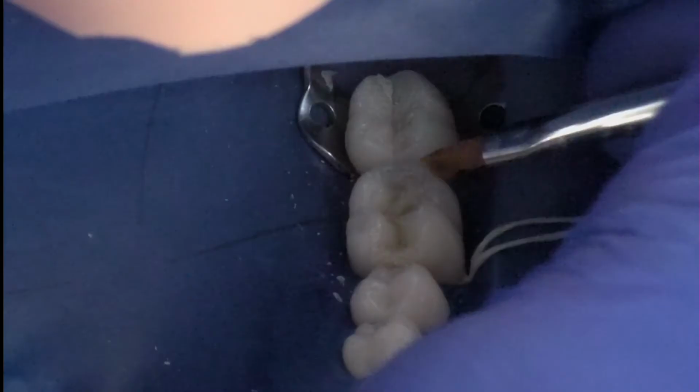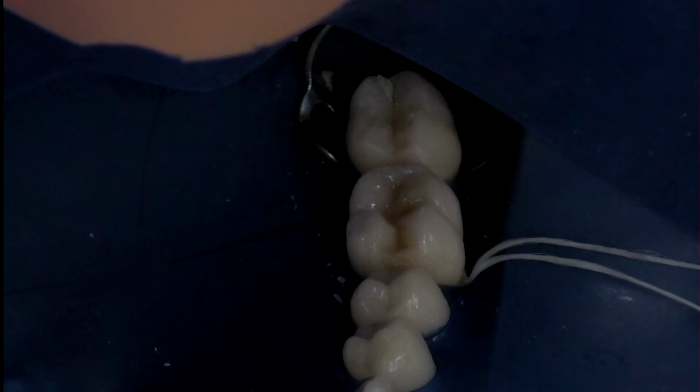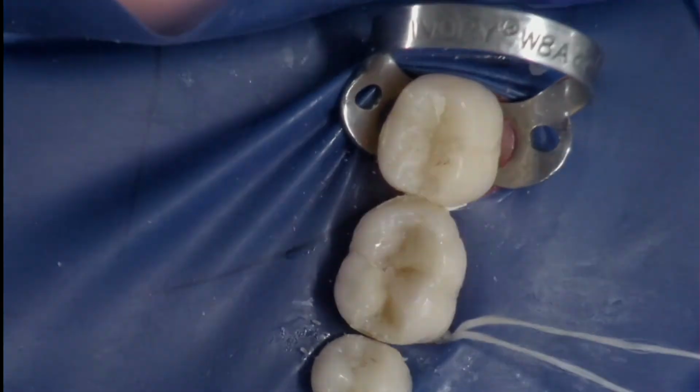And here I use a paintbrush. This just helps smooth out that last layer and make sure it's nice and smooth and won't be catching any bacteria for the patient in the near future. And one final cure, and there's the tooth.